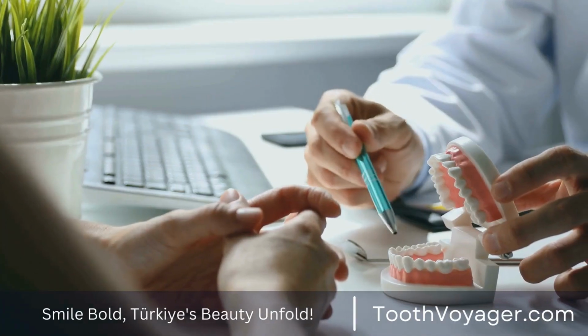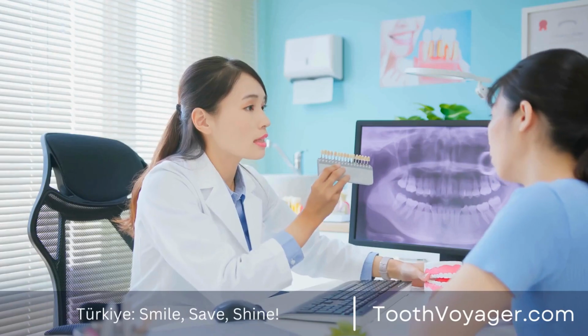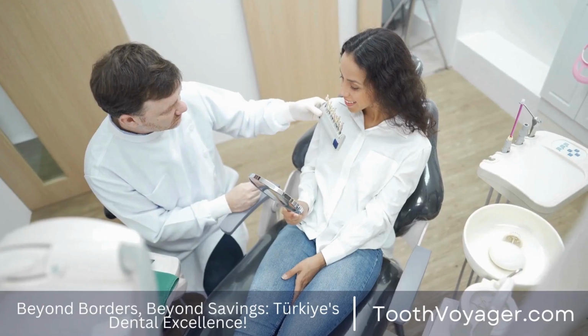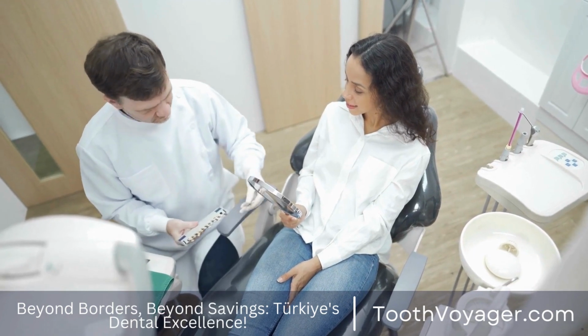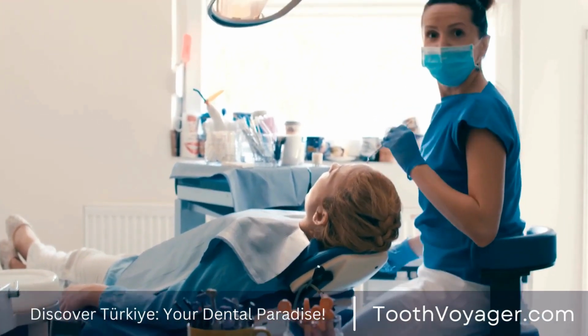Dentures, however, are appliances that can be removed, which are utilized to substitute one or more missing teeth. Dentures are either complete or partial, based on the number of teeth to be substituted. Full dentures can be used when all the teeth on the lower or upper jaw are missing. On the other hand, partial dentures can be used when only a handful of teeth have been lost.